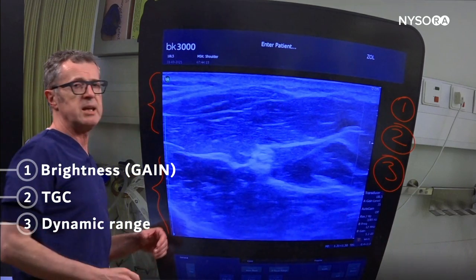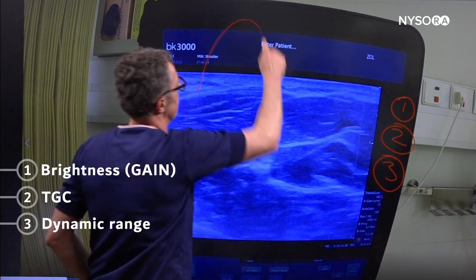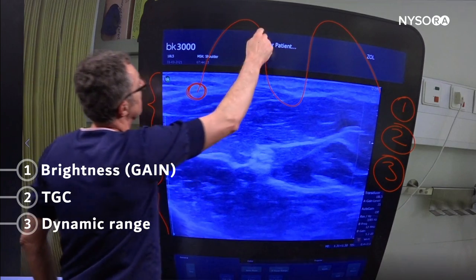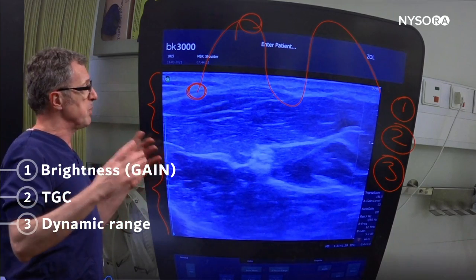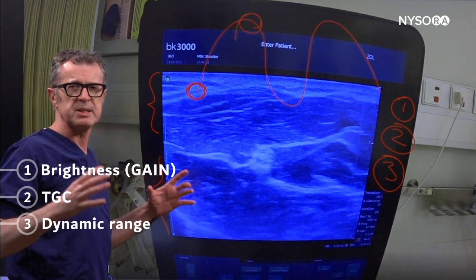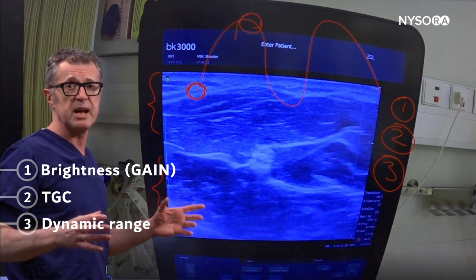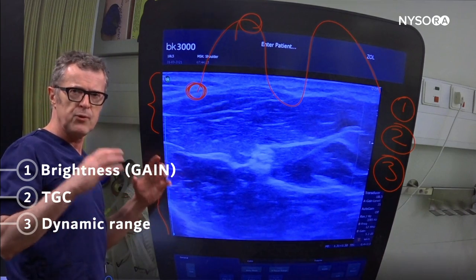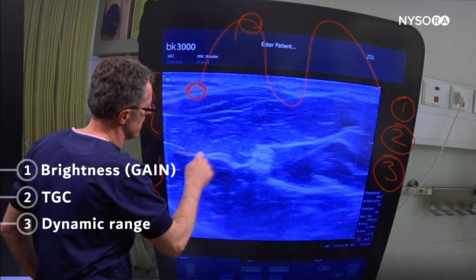Number three is something called dynamic range. Ultrasound waves have their own dynamics — there are returns to the probe that are very weak and signals that are extremely strong. When the dynamic range is very wide, the difference between the weak and strong signals is too much to get a contrasty image that helps you recognize the fascial planes. In this image the contrast is as much as 90 decibels; we'd like to compress that to get a tighter, sharper, more contrasty image.